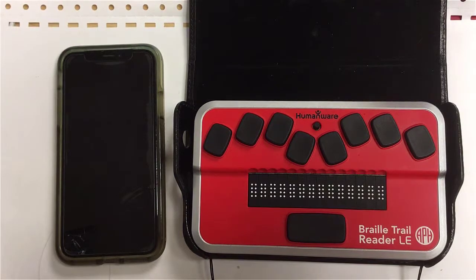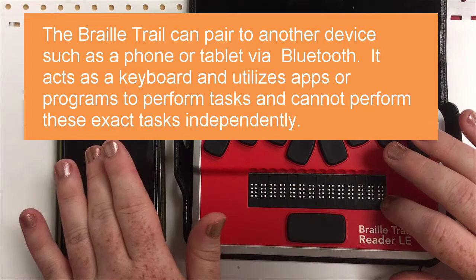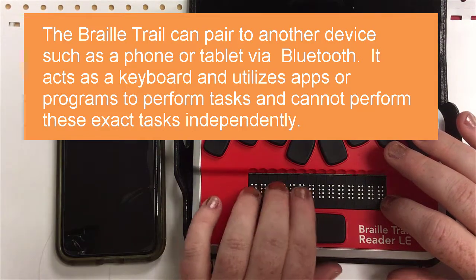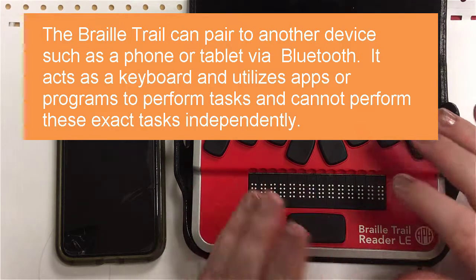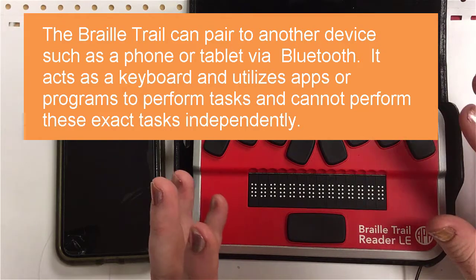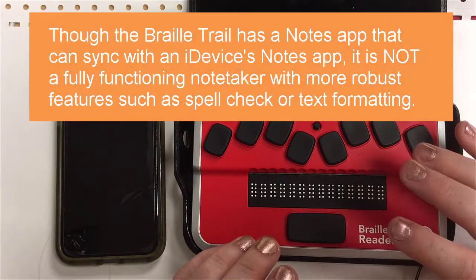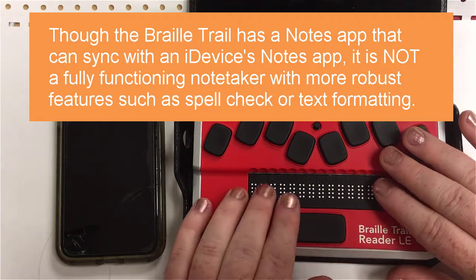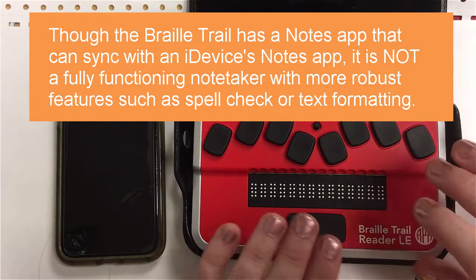In this section of our BrailleTrail reader tutorial, we're going to talk about pairing our device with an iOS device. Before we get started, I want to make sure everybody knows the difference between a Braille display and a note taker. This is a Braille display — it has the capability to pair like a Bluetooth keyboard with an iDevice, Android device, or a Windows device. It uses the features on that device to do things like email, writing a more complex assignment, and spell checking. The only thing that really syncs across your phone and the Braille display are your notes.